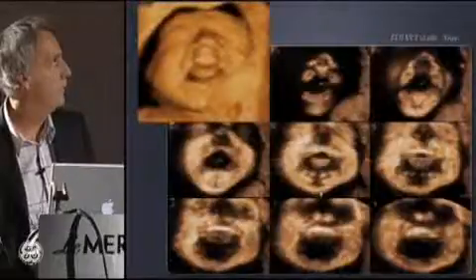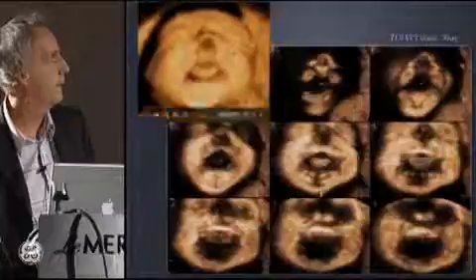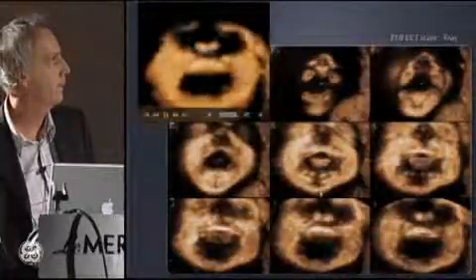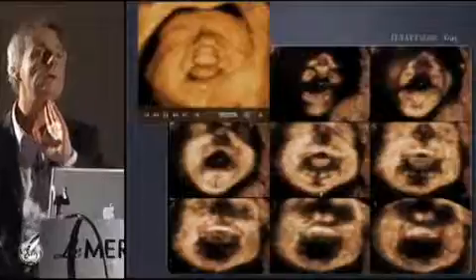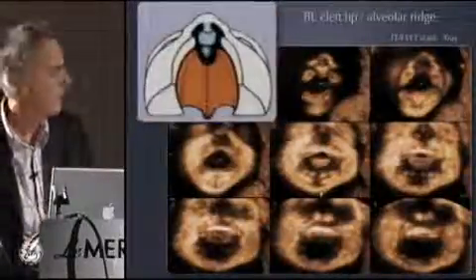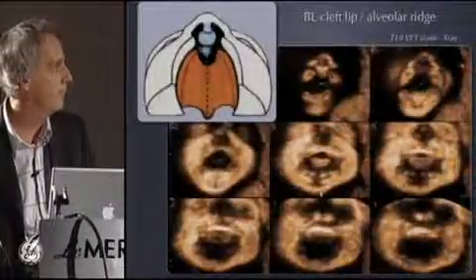The same, I fly through the face, and you can see here the palate. But you can obtain this kind of rendering only if you do the acquisition from here. So this was this case.